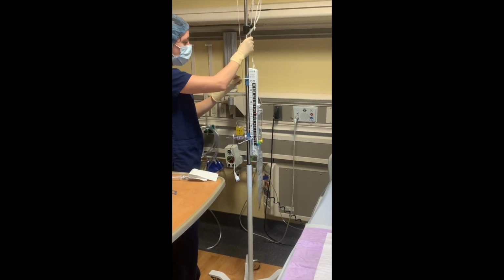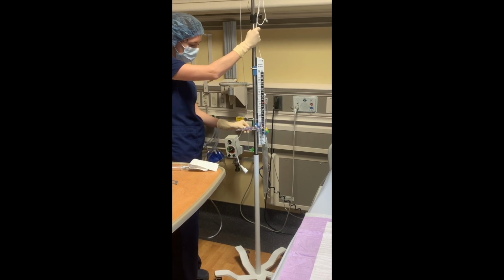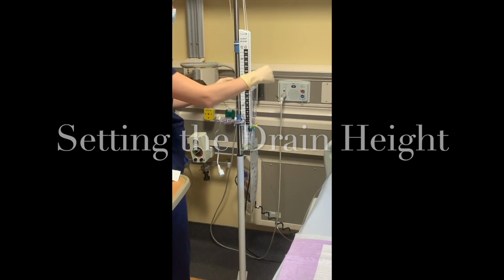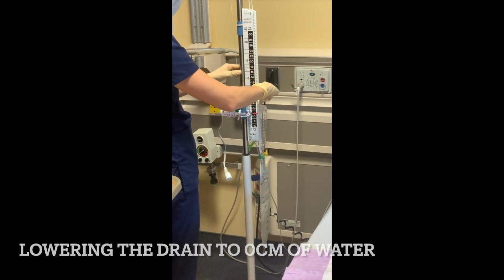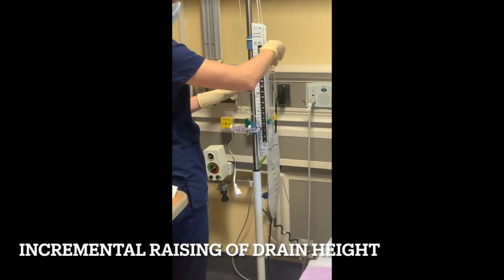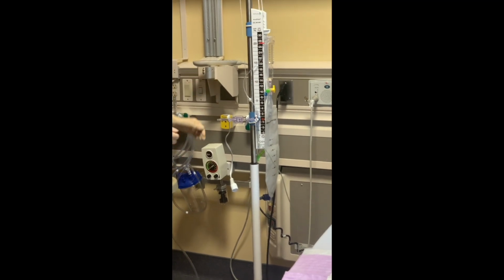Once the collecting system has been leveled to the patient's external auditory meatus and the collecting system has been adhered to the IV pole, you're able to set the drain height. You'll see here that the collecting system is brought down to the 0 position and then incrementally moved up to 0, 5, 10, 15, or 20 centimeters of water.